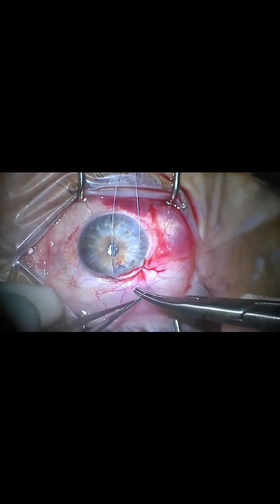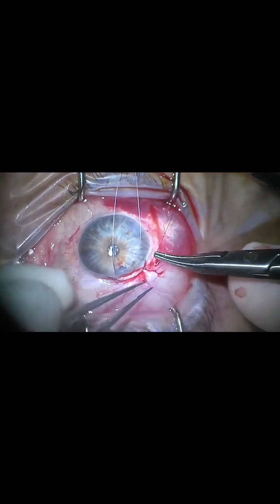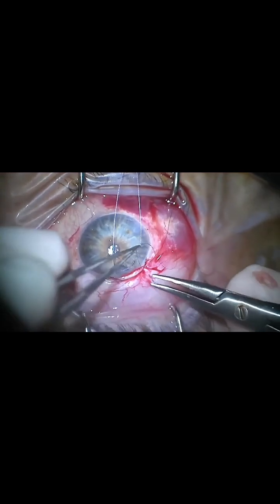Here we see that area of redundant conjunctiva being secured with 10-0 nylon in a running fashion.